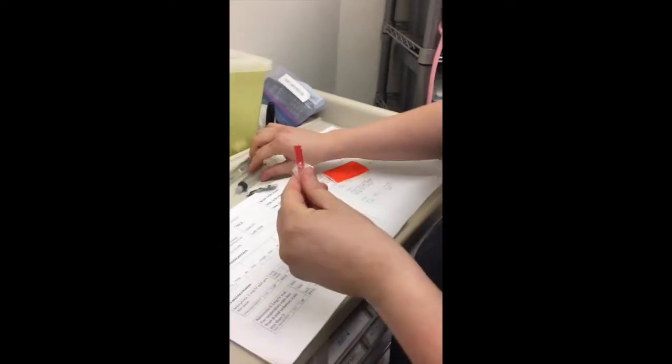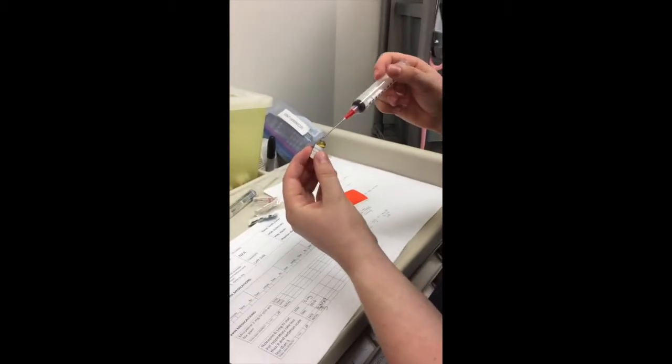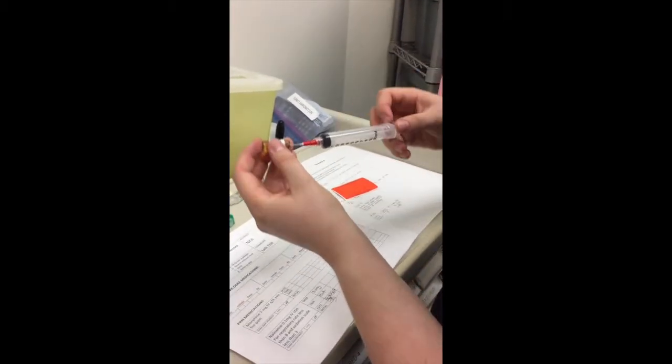Now I'm going to withdraw it from here using a blunt fill needle to make sure we're keeping everything sharp free. Sarah will still be with me because she has to verify I've taken all the morphine out of my little ampule. So I'm getting this in.